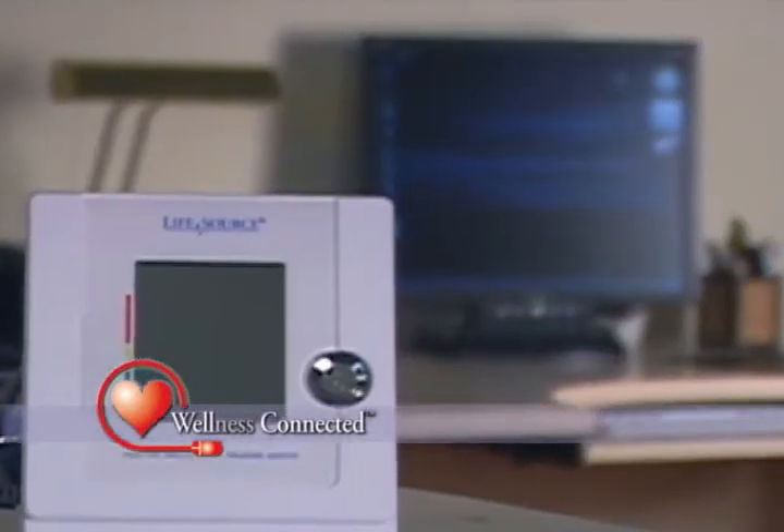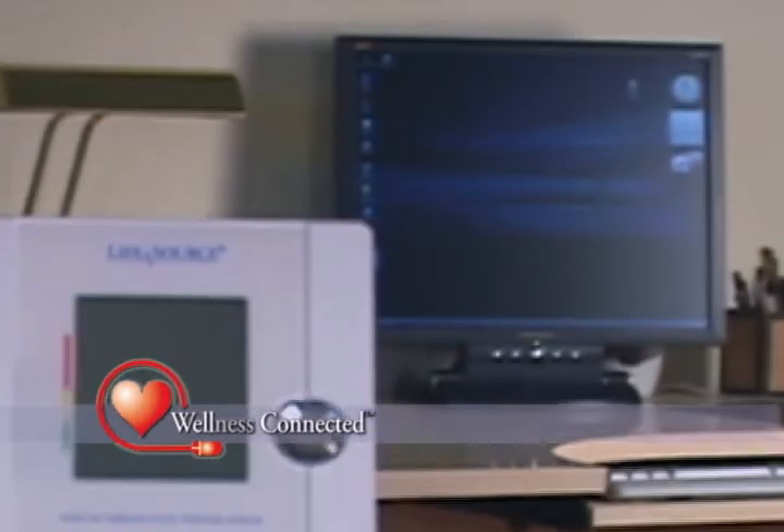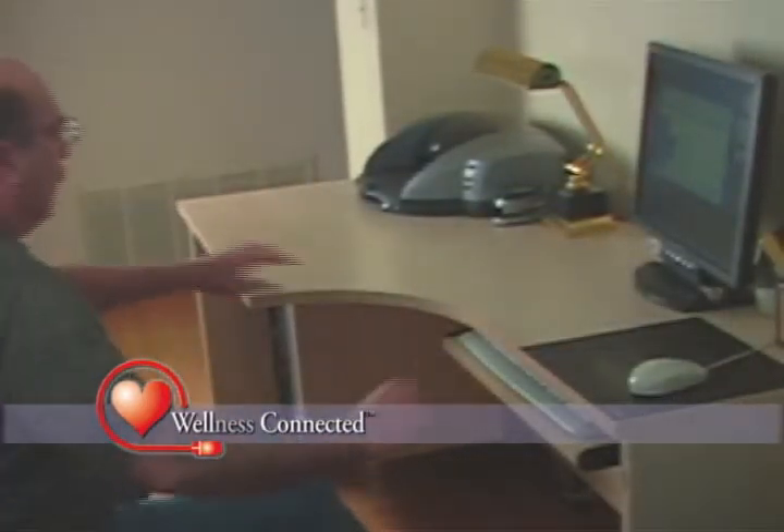In seconds, your wellness data is transmitted wirelessly and automatically to the ActiLink transceiver, and your results are clearly displayed on your home computer.